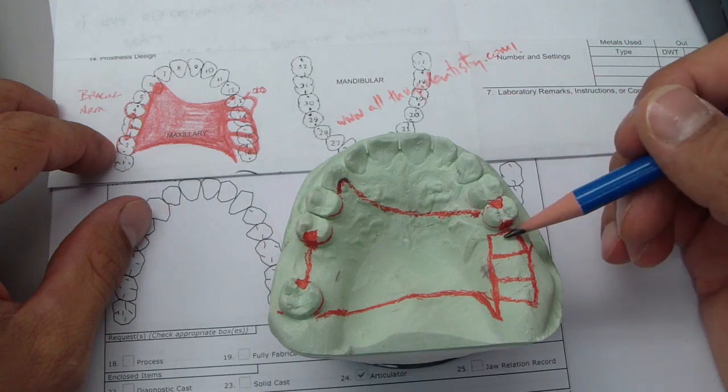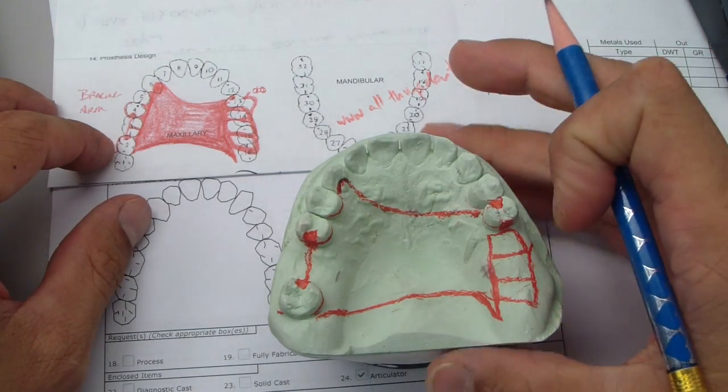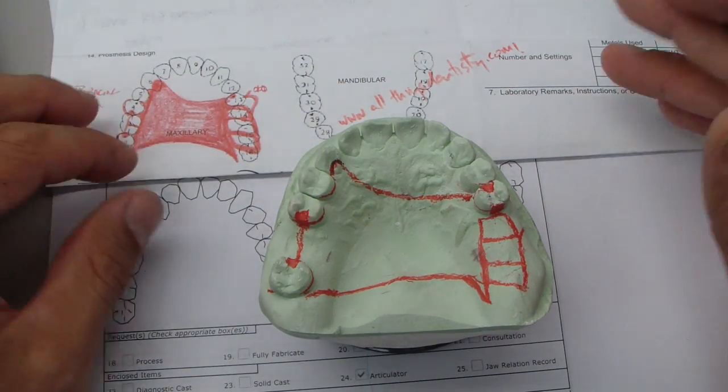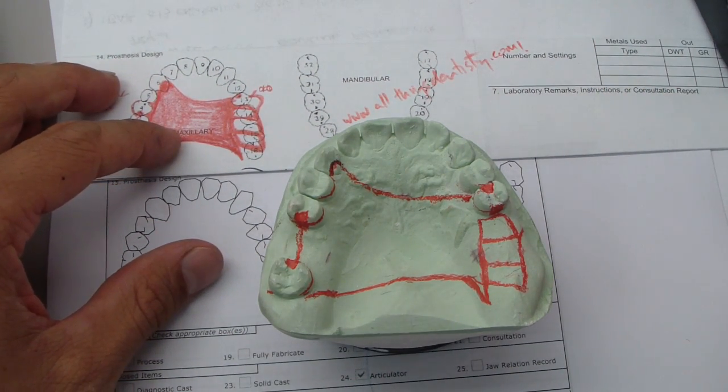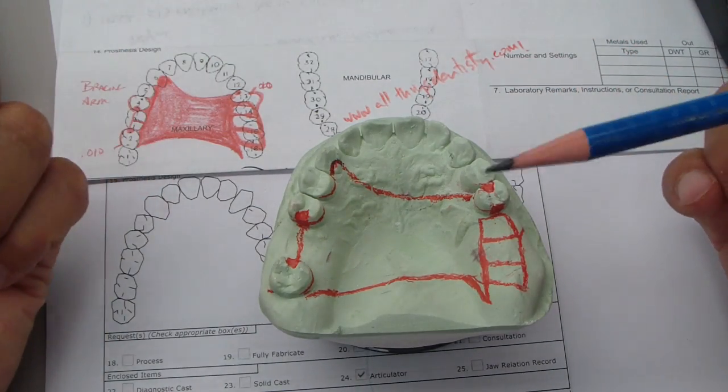This patient here has an edentulous ridge here and also we're missing a tooth here. Now when you're designing, I left dental school and I forgot how to design an RPD and I would just use what existed. Well in this case nothing exists, so this was a really good learning experience for me.